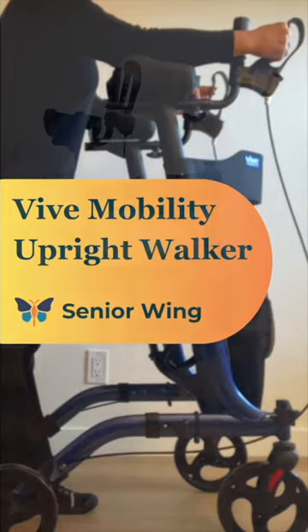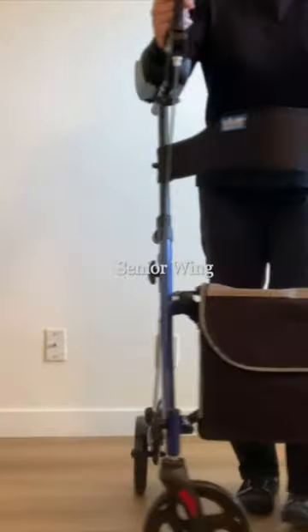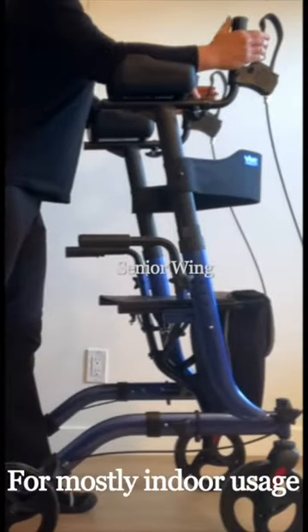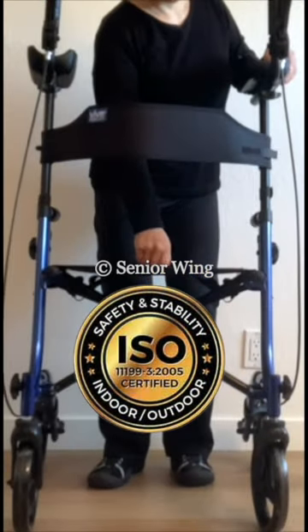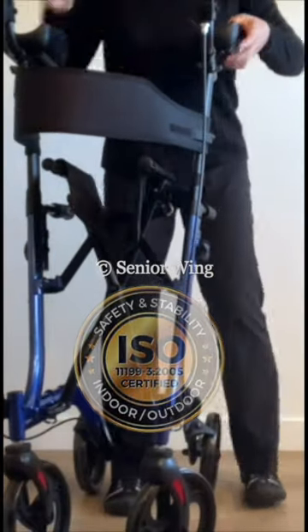If you need an upright walker, the Vive Mobility is a solid choice if you're relatively average in size and want something lightweight for walking mostly indoors. It's one of few upright walkers that are ISO certified, meaning a third party approved that it meets safety and stability standards.